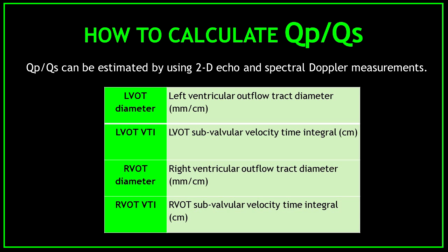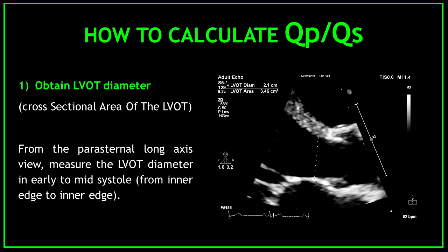First, the LVOT diameter. Second, the LVOT VTI. Third, the RVOT diameter. And fourth, the RVOT VTI. To calculate the QPQS ratio, I'm going to show you step by step how to obtain the measurements you need.